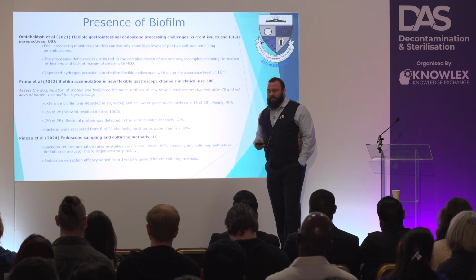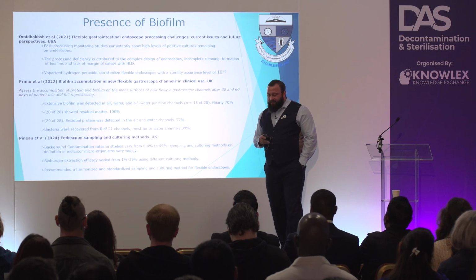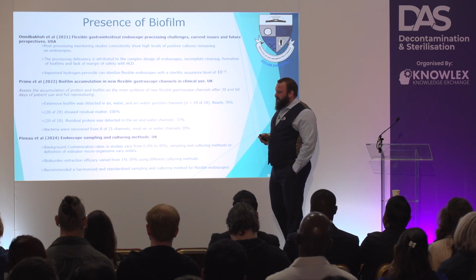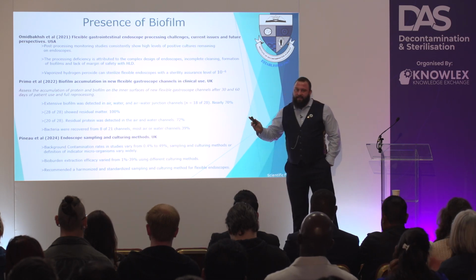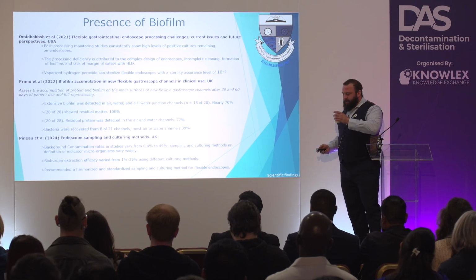Again, another risk with biofilms. And it's recommended that a harmonized standard sampling and culturing method for flexible endoscopes is adopted. And that's the work that Mr. Pinu is doing at the moment, and the ISO is in draft.